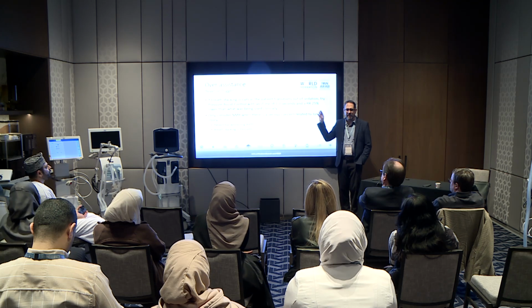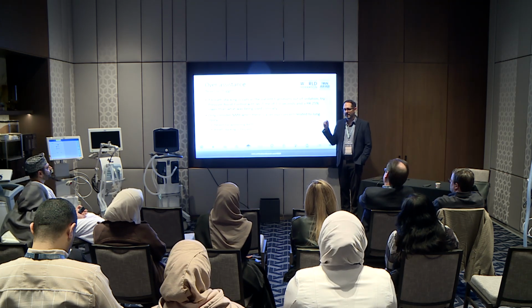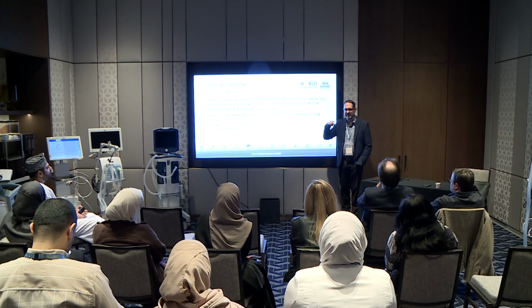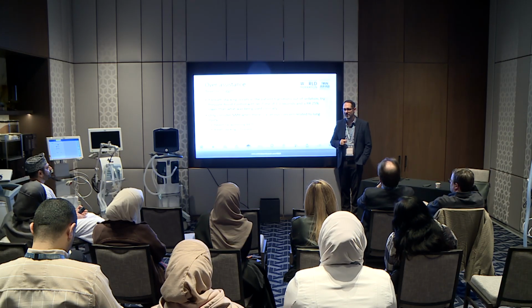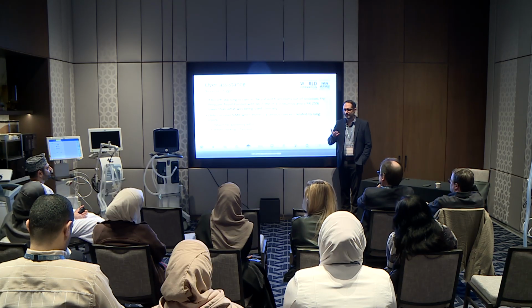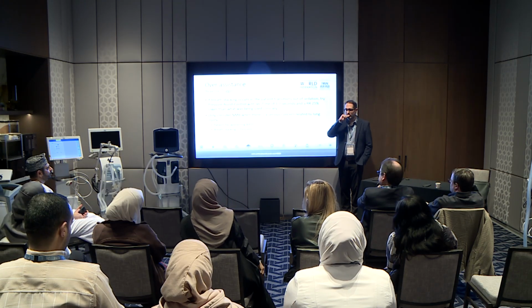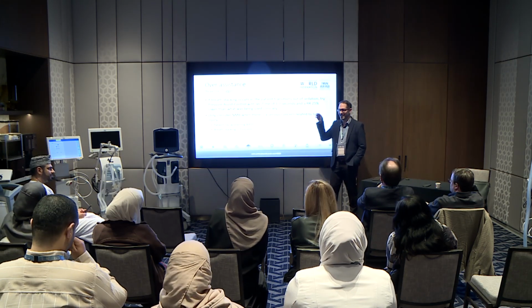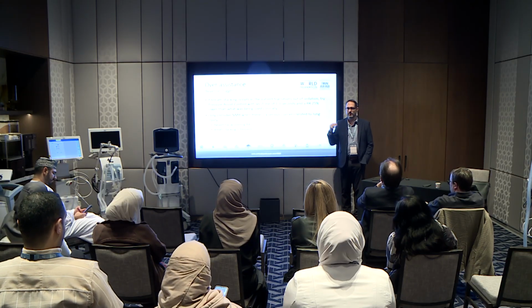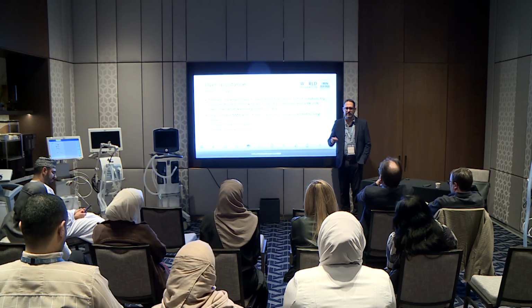Many, many times when people don't recognize asynchrony properly, what do you think they do when they see weird triggering and breath stacking on the ventilator? What do you think they do to the patient? Sedate them. Increasing sensitivity. Yeah, they might do a number of things, but essentially if they see reverse triggering with breath stacking, the response is almost always, they just sedate the patient.